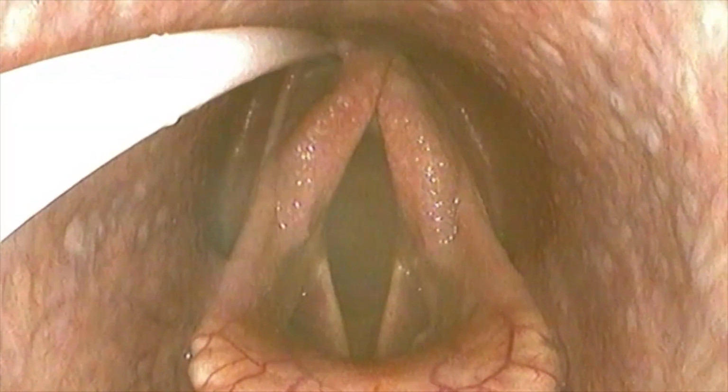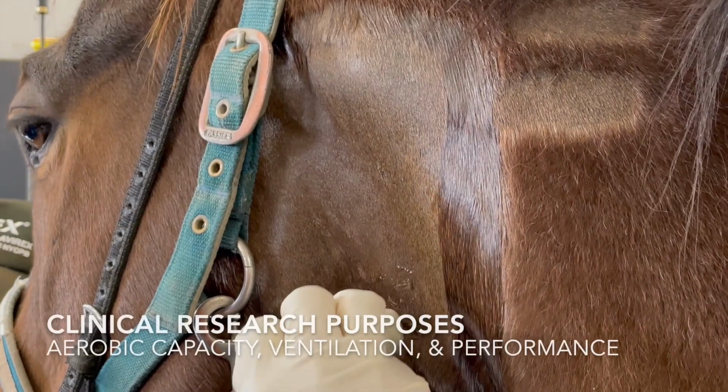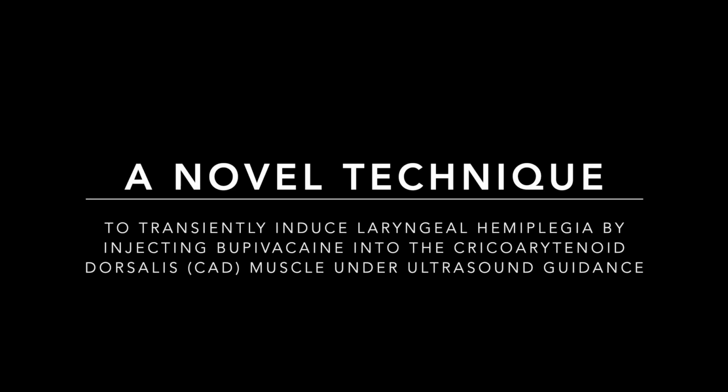In clinical research, this can be modeled by temporarily suppressing the recurrent laryngeal nerve, creating a reversible form of laryngeal hemiplegia. This model allows researchers to investigate a range of cardiorespiratory conditions, including the effects on aerobic capacity and ventilation. The challenge, however, is that performing a nerve block of the left recurrent laryngeal nerve is technically difficult. The aim of this tutorial is to demonstrate how to transiently induce laryngeal hemiplegia by injecting bupivacaine directly into the CAD muscle using ultrasound guidance. This technique is intended solely for research purposes.